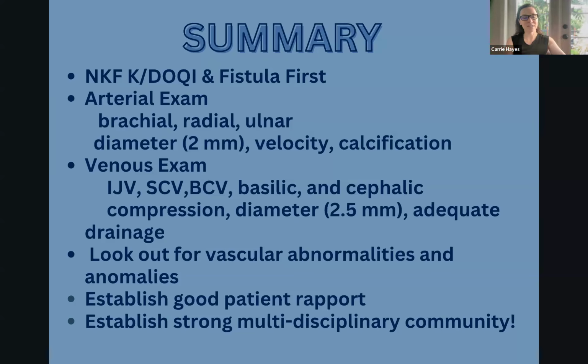I'm concerned. I can't see the radial well, but the ulnar is kind of small. You guys want to be able to talk through this, and then also to be able to reach out to the surgeon and say, hey, I saw your patient today. I know you're in a hurry to get this done, so we've got this, this, this. They're good to go. So I think having that community is key.